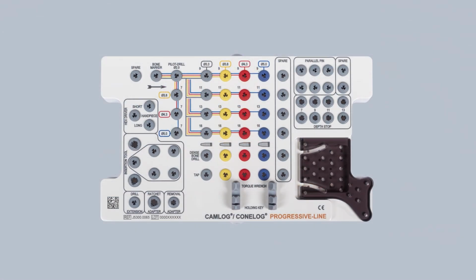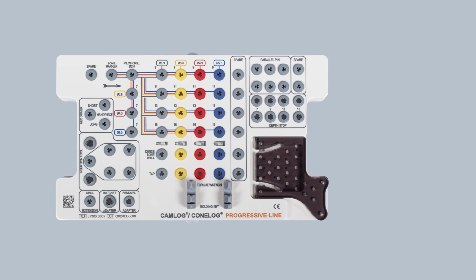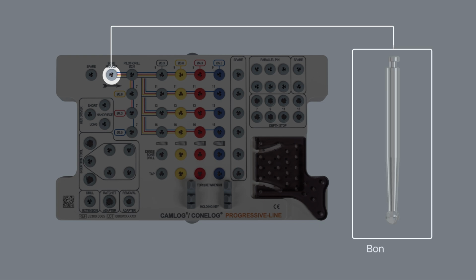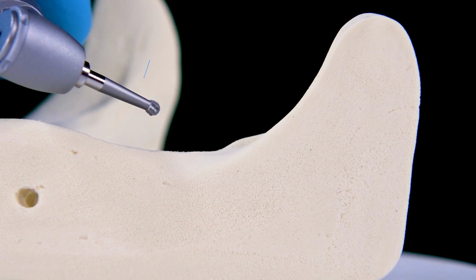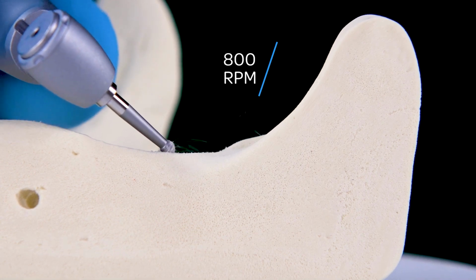The drilling sequence for a CONELOG progressive-line implant, diameter 4.3 mm and length 13 mm. The round burr is used for punch marking the cortical bone, which simplifies the use of the drills to follow. In the process, the spherical tip of the round burr is lowered to the equator.